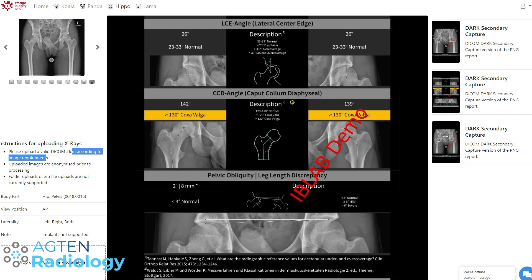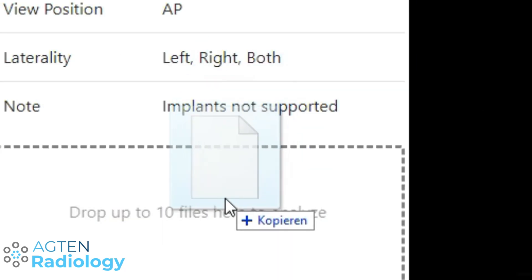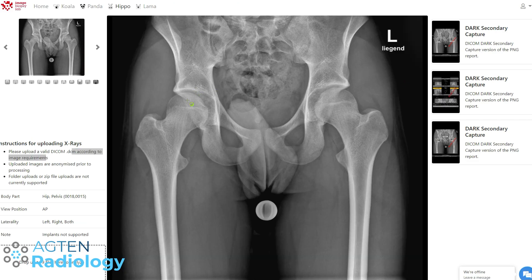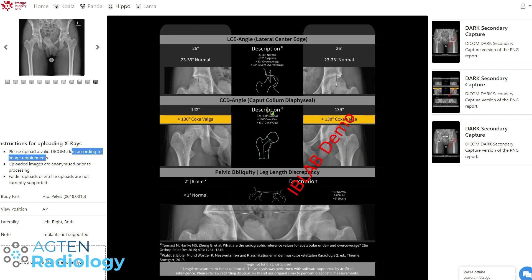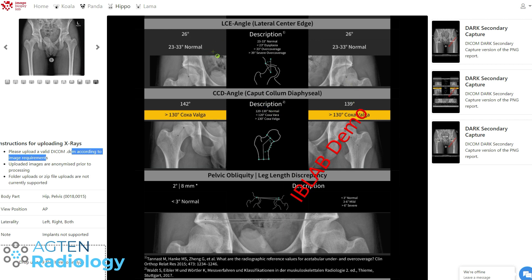Let's upload the same case again — we just have to remember: 26, 26, 140. Uploading the same case again. Before opening it, would you say it has to come up with the same result, or could it show something different? It should be fully reproducible — so there's no randomness; it's always the same with the same image. Is that a general concept in machine learning and deep learning? It's not always guaranteed, but it's a highly desirable goal. Result: 26 was the same angle, and these ones are the same as well. Very good — fully reproducible.